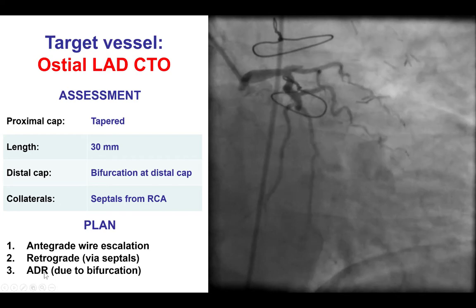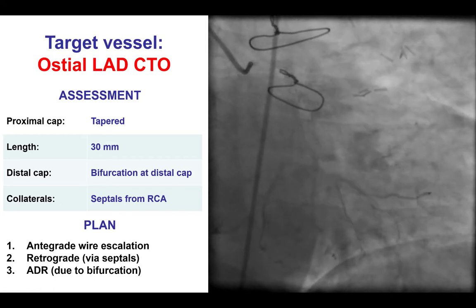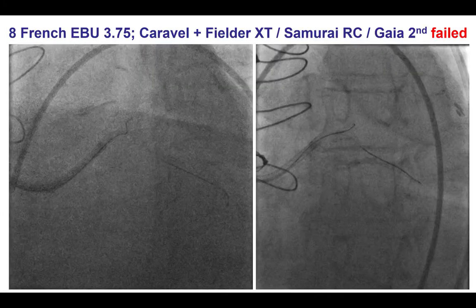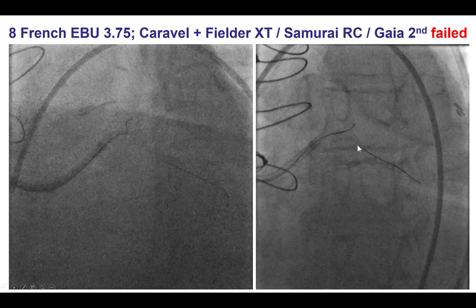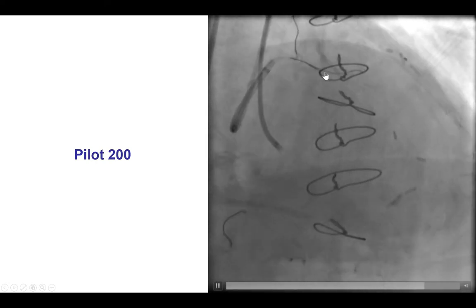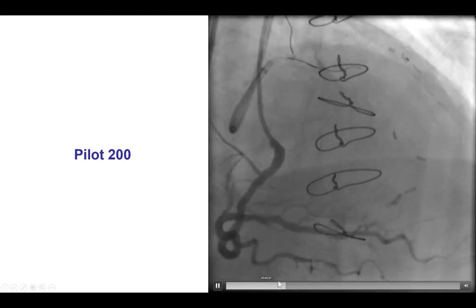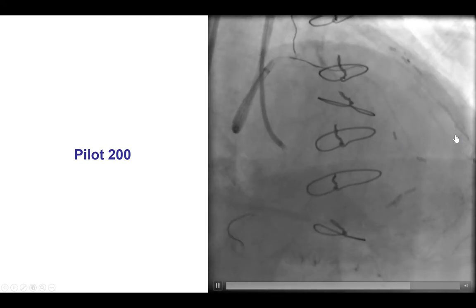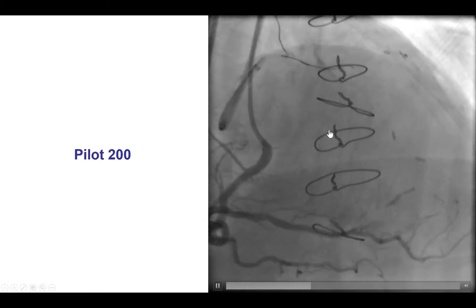Although we have shown recently that one can do re-entry into both branches and achieve good re-canalization. Escalation was done with the Caravel, Fielder XT, Samurai RC, and Gaia 2nd, but did not progress much. In cases with proximal LAD, it is advisable to have a safety workhorse wire into the circumflex in case there's a dissection or some issue at the ostium of the circumflex or the left main. There is a dual injection with the wire trying to be advanced from the LAD, and we do see the LAD filling via septal collaterals, with a bifurcation on the distal cap.